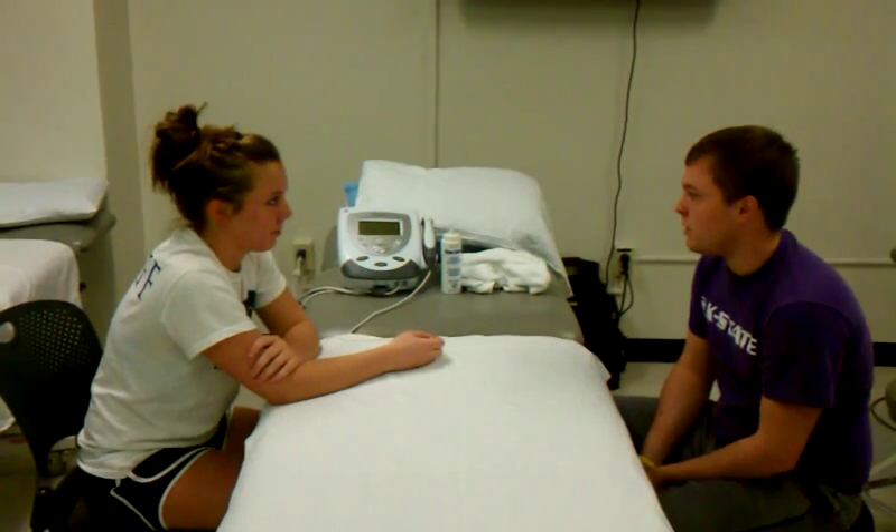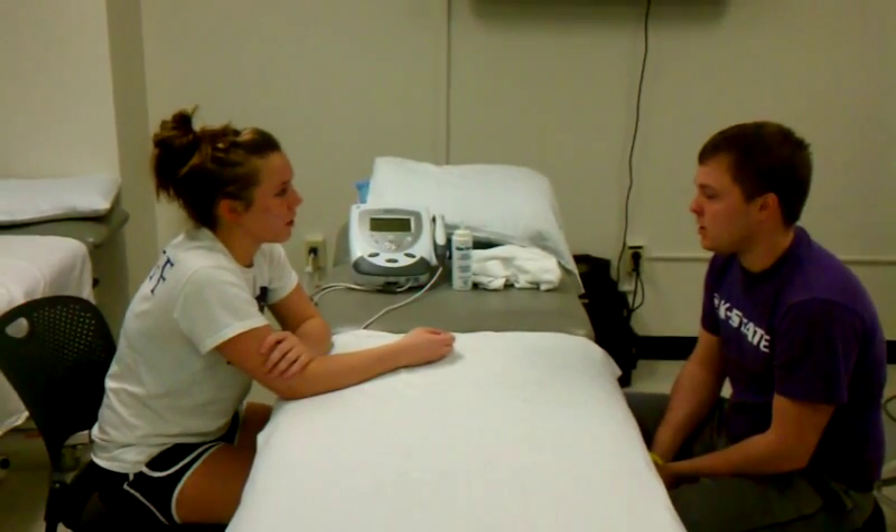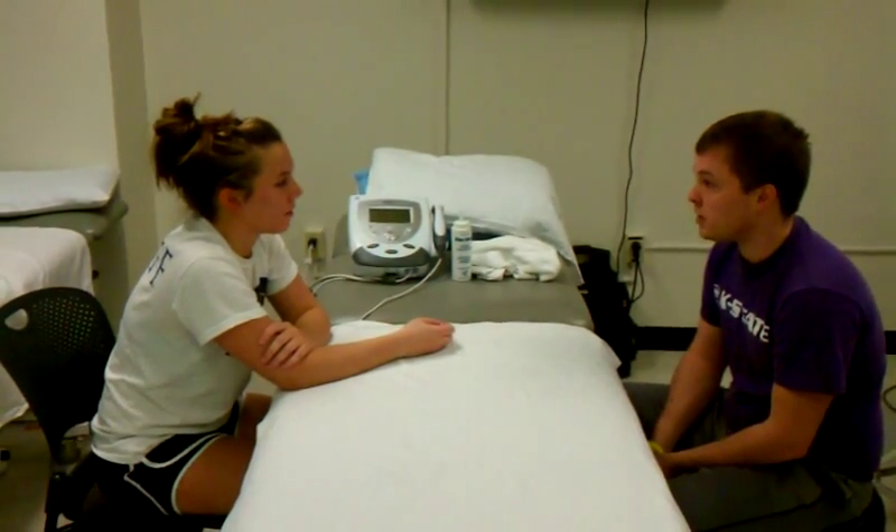Well, today we're going to do some ultrasound for you. We're going to start with getting it going, find the intensity that we want to do, and then we'll go from there. Okay? Awesome.